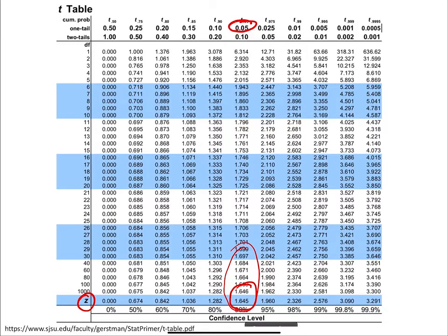Even without doing anything, when you're looking at your data, you can get a good sense that a t of 1 means the signal and noise are about the same. So I need that value to be about 1.6 before I can pass a one-sided t-test. If I do two tails, the threshold is slightly larger. You can see here, I need about 1.9 or about 2.